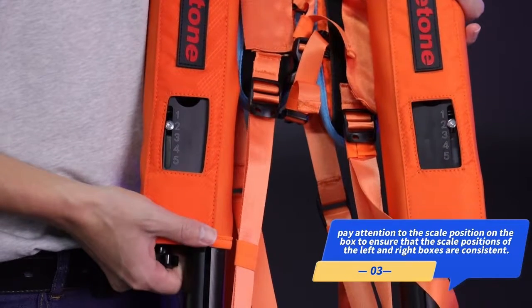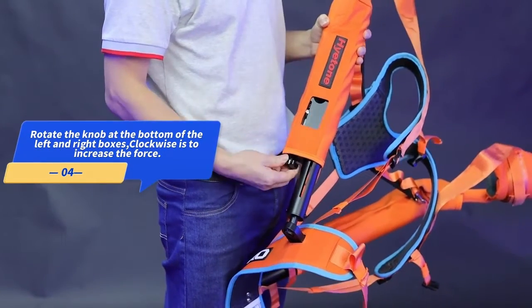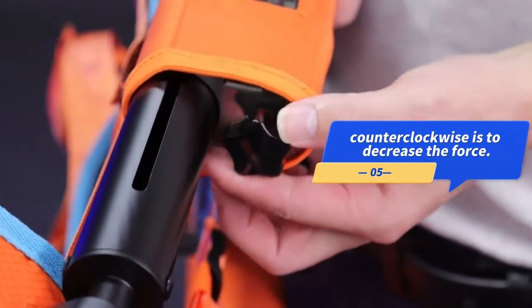Pay attention to the scale position on the box to ensure that the scale positions of the left and right boxes are consistent. Rotate the knob at the bottom of the left and right boxes — clockwise is to increase the force, counterclockwise is to decrease the force.